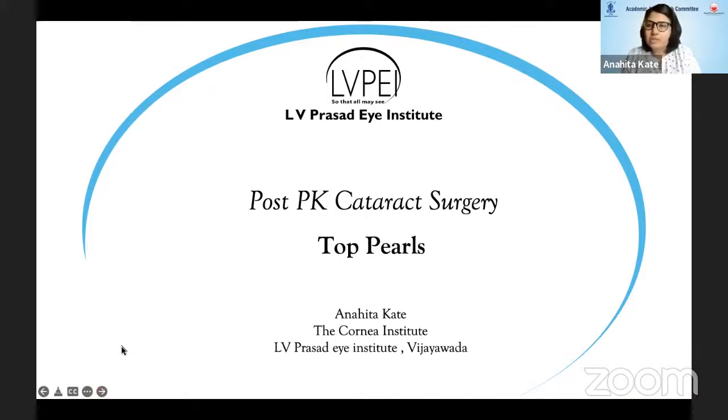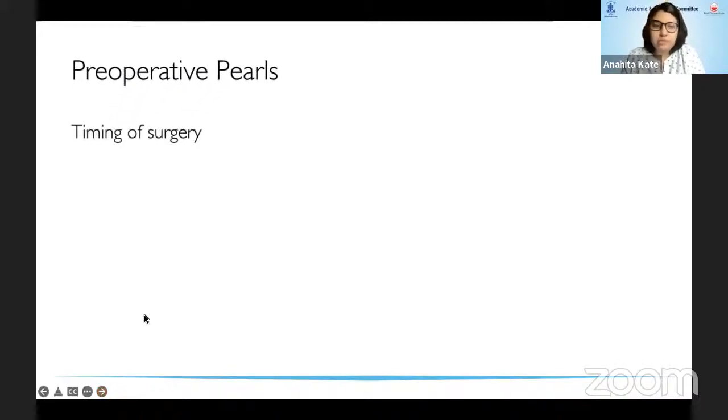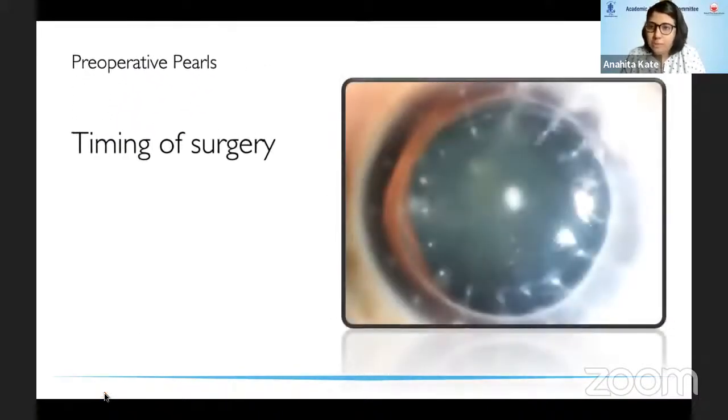Post-PK cataract surgery is often a daunting task and requires a very nuanced approach to each step. Today I will be sharing my top preoperative and intraoperative pearls to ensure the best outcomes in these eyes. Starting with the preoperative pearls, the first question is, when would you consider operating in such patients? The ideal time to operate would be when all the sutures are out and the corneal topography is stable.